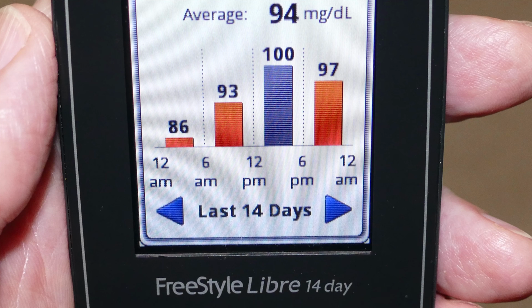And then from 6 p.m. to 12, it went down slightly to 97. So you may ask, Dennis, why was the 12 to 6 p.m. your highest number? And the answer is actually pretty simple. That's when I eat my highest carb meals.